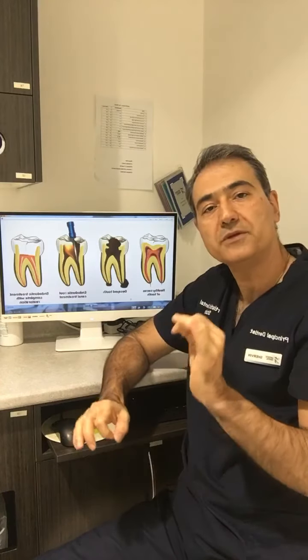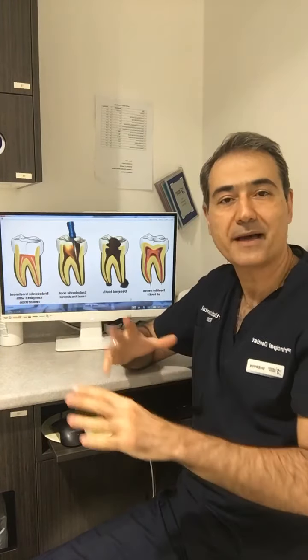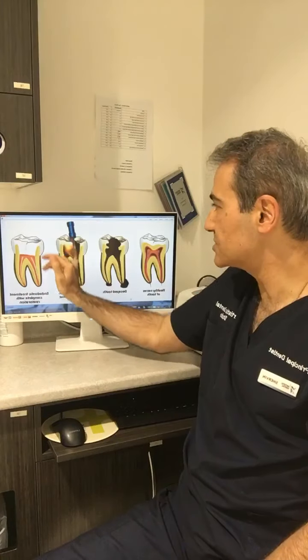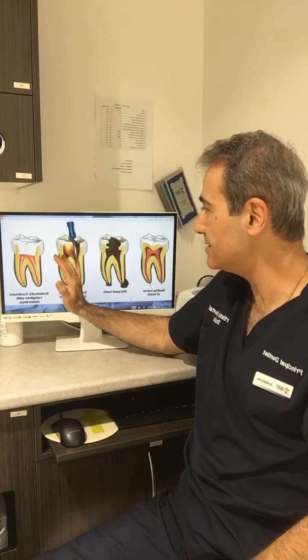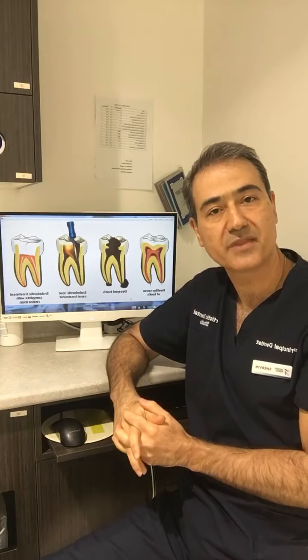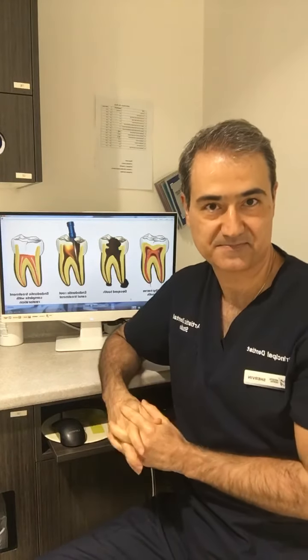So basically what we need to do is to make sure we can eradicate this infected material, the nerve, the bacteria, everything, by insertion of some tiny needles into the tooth to clean the tooth up, and after a while fill inside the root with some kind of plastic material so we can make sure the infection will not get back. This is the root canal treatment.